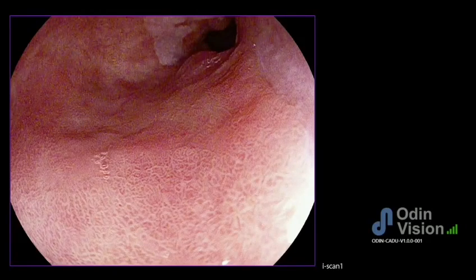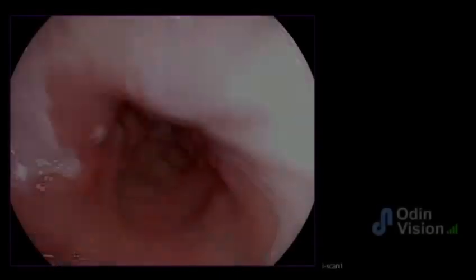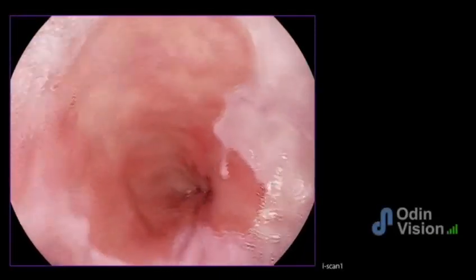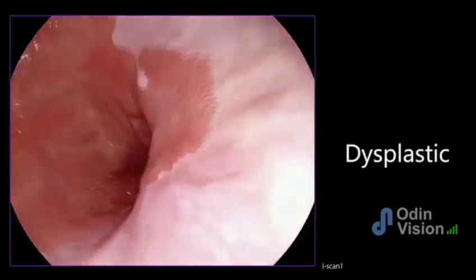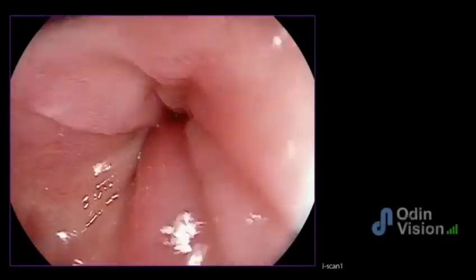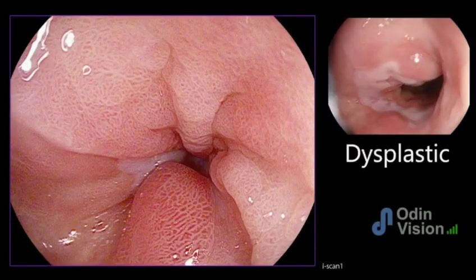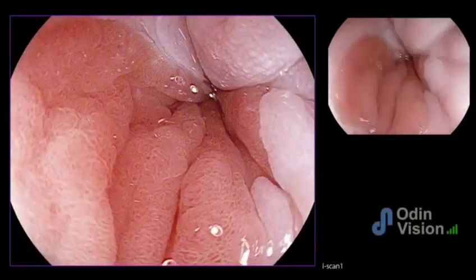So let's make a prediction in a second by pressing the pedal on a per image level and looking at an overview of the whole Barrett segment. It's telling us it's dysplastic. Let's look again, give it the best chance by washing the Barrett's mucosa very clearly to give clear views, and let's make another prediction, and it's telling us this is a dysplastic Barrett segment of concern. Let's focus on an area of abnormal tissue here and make another prediction, and it tells us it's dysplastic. And let's look at the left nodular wall here and make another prediction, which tells us it's dysplasia.